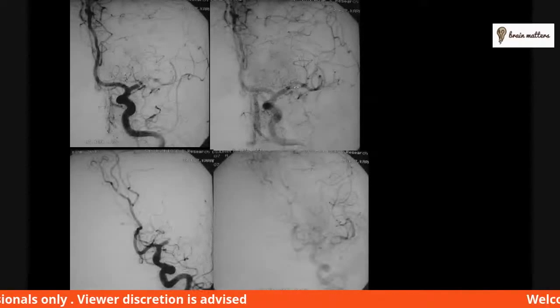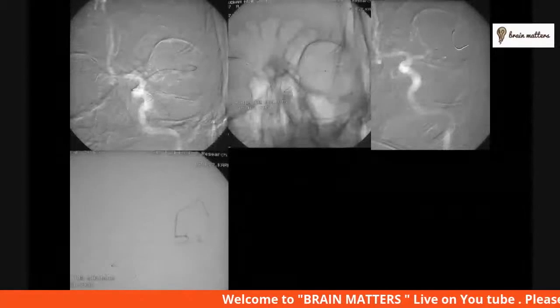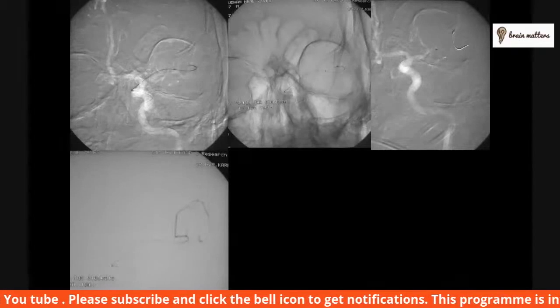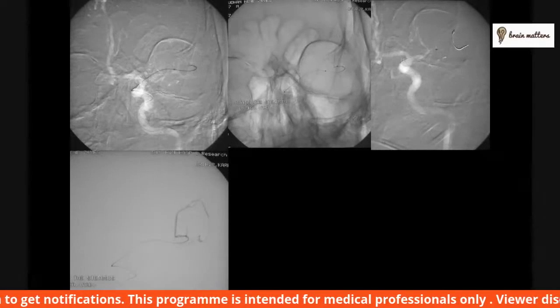Since he had recently become symptomatic, I felt that we should go ahead and do something. Of course, there was a debate, should we not? But finally, the son said, no, you go ahead, let's do what we can. So there was that short segment total occlusion of M1.